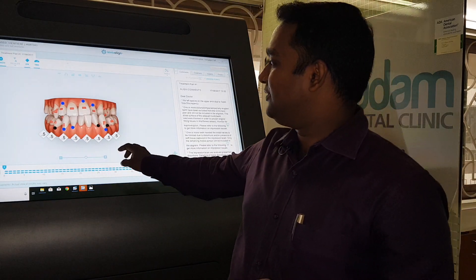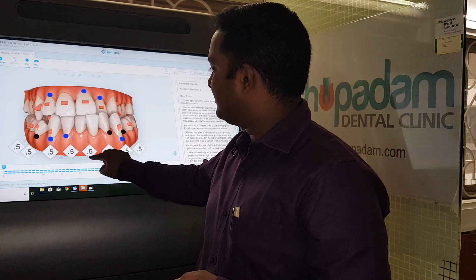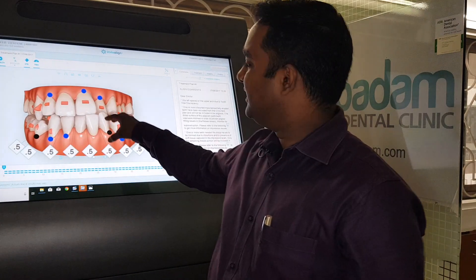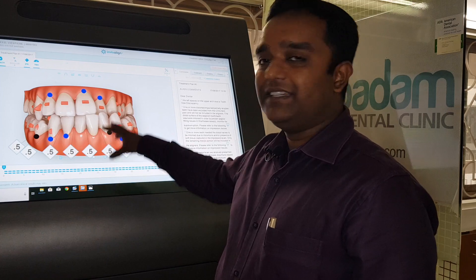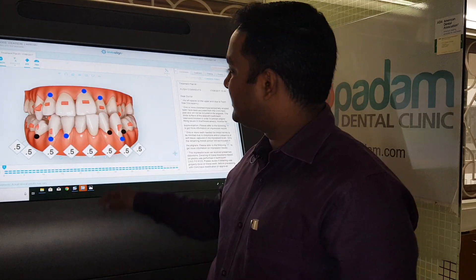Invisalign is an orthodontic tool to correct malaligned or forwardly placed teeth. In this video you can see a crowded case — some of the teeth are crowded. I will show you how it works in such a case.